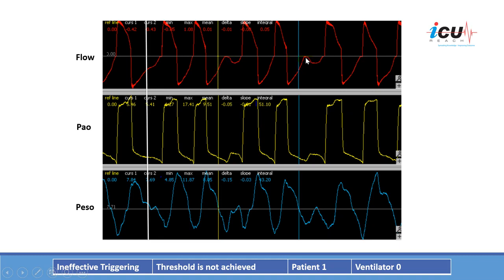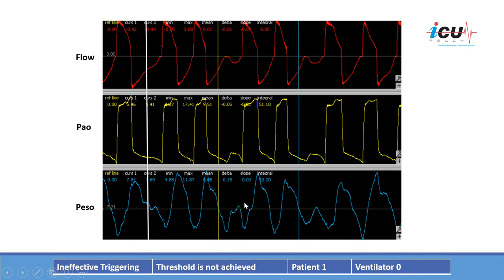Similarly, in this breath here, you can see a drop in esophageal pressure with a rise in flow without the ability to trigger the ventilator. This is ineffective triggering — the triggering threshold is not achieved. It results in one patient breath and zero ventilator breaths: the patient had inspiratory effort, but the ventilator delivered no breath.